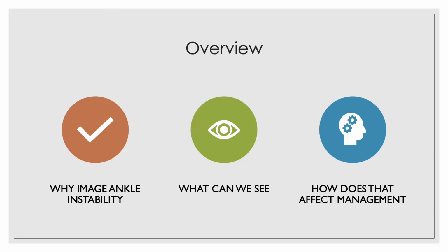Okay, I'm going to move on to the section on ankle instability. And here we're going to talk about three things. Why do we image ankle instability? What can we see, and how does that affect our management?